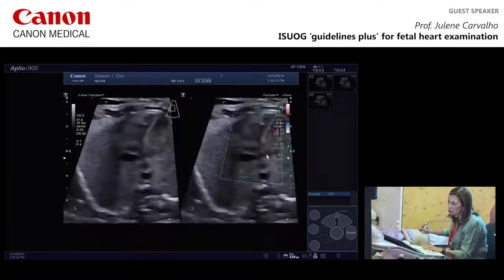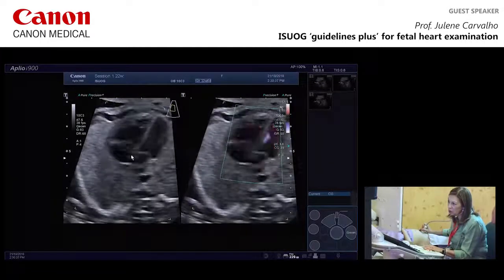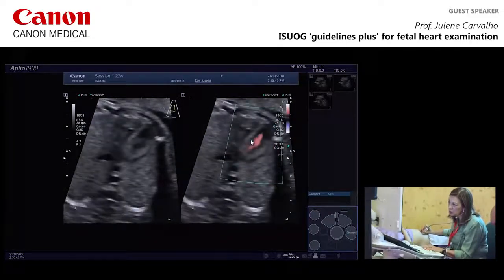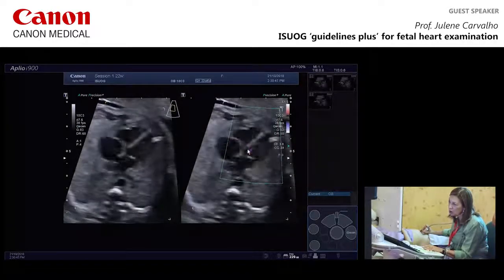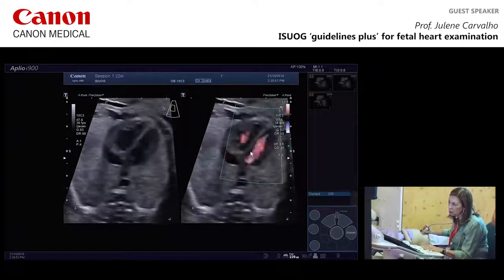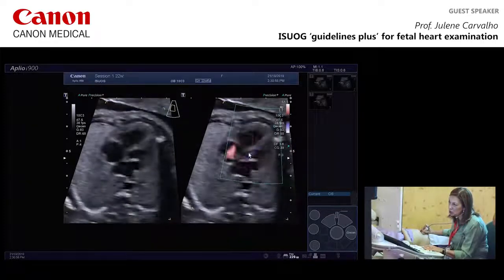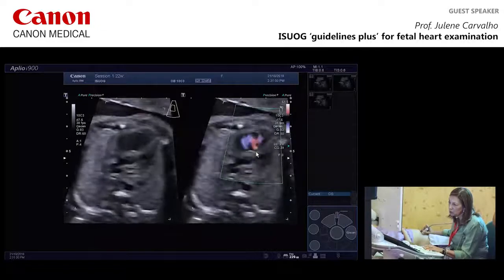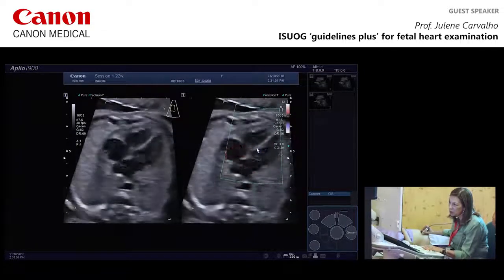And you see at that stage, you don't really see the mitral valve. Then as you move anterior, there's the mitral valve, normal offset. And it's very nice for doing a sweep between the posterior part of the septum, so no ventricular septal defect at the back of the heart. Anteriorly, very slowly, we're looking here for the perimembranous area, so that brief sweep here, but slow, between four-chamber view and the left ventricular outflow tract. You know there is no ventricular septal defect. You can see that I'm rotating my probe slightly just to be more perpendicular to the septum.